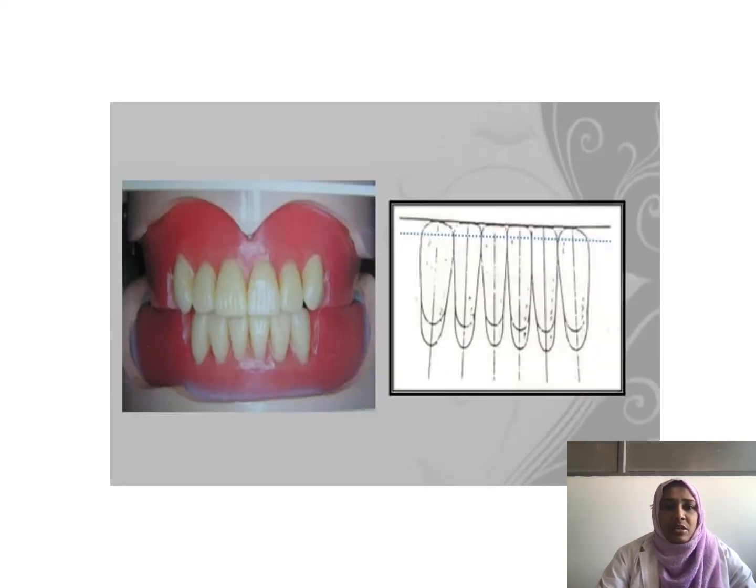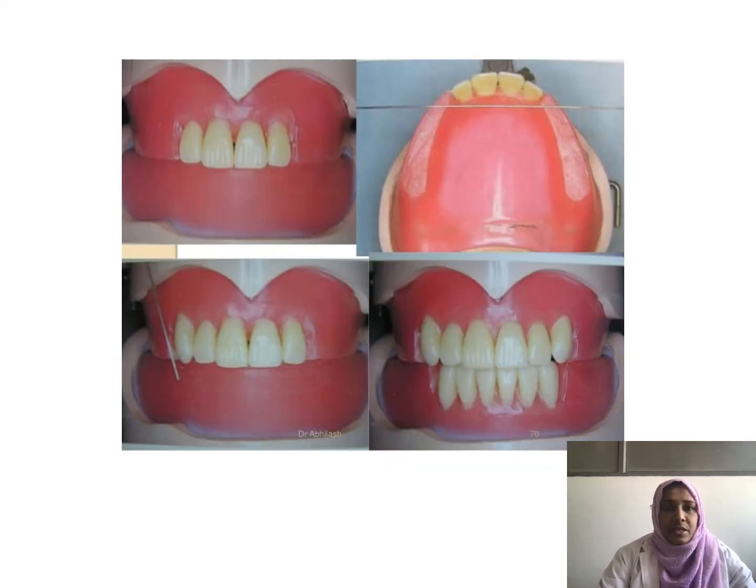This is all the views of the photographs of the arrangement of the upper and the lower anterior teeth. This is how we will arrange. These are the pictures viewed from the occlusal surface.